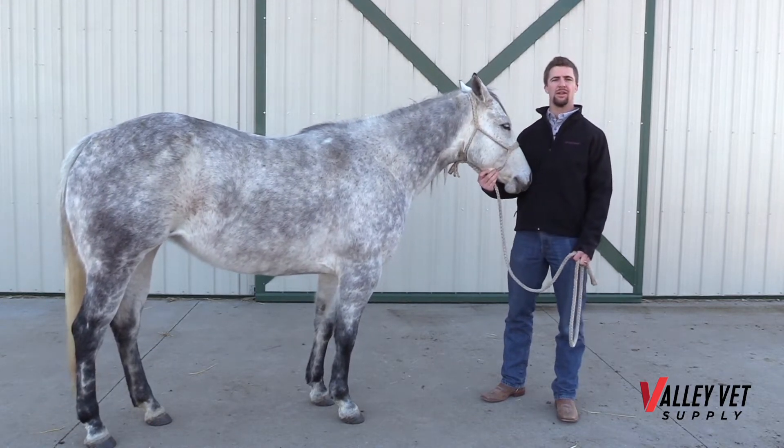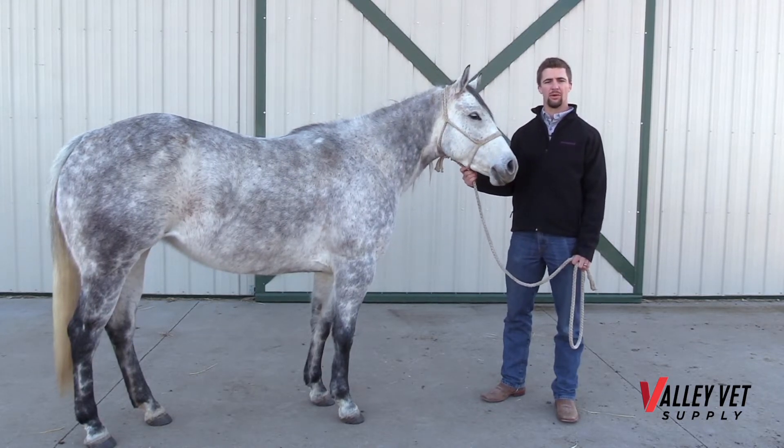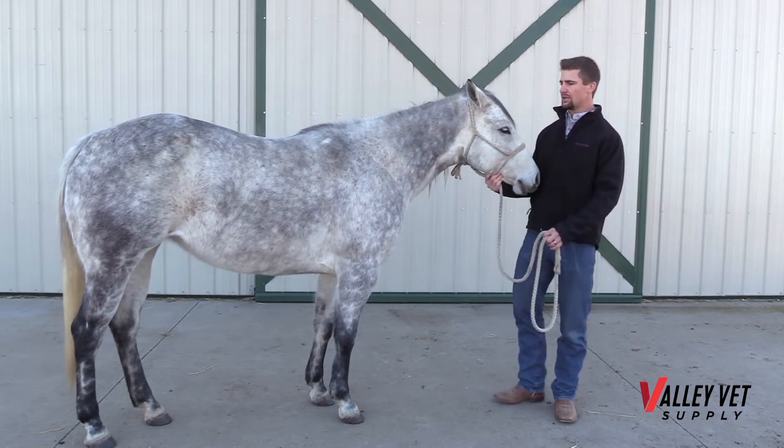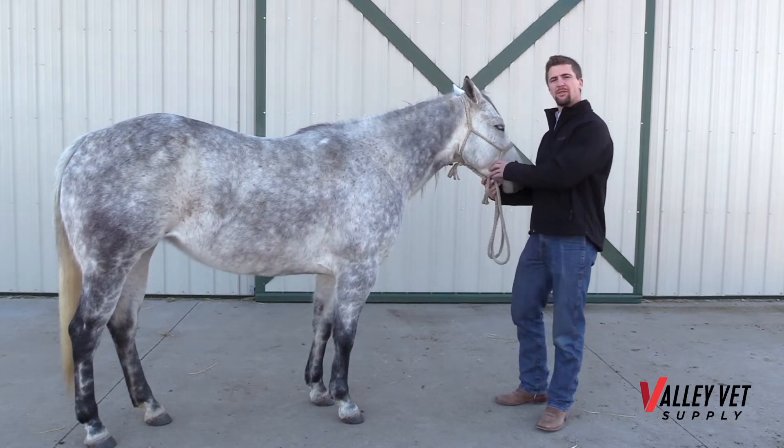We generally use an inch and a half length needle and an 18 to 20 gauge, depending on the thickness of what we're injecting. Most medications and vaccines are administered intramuscular.